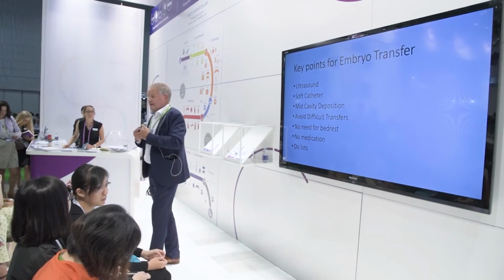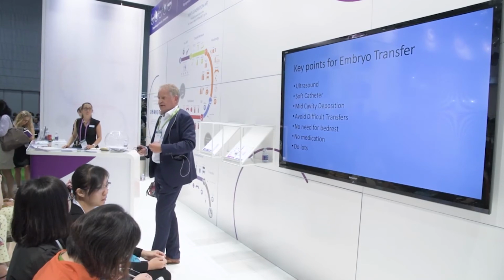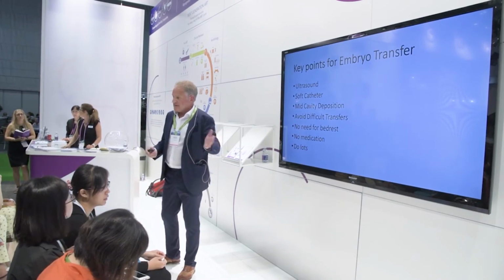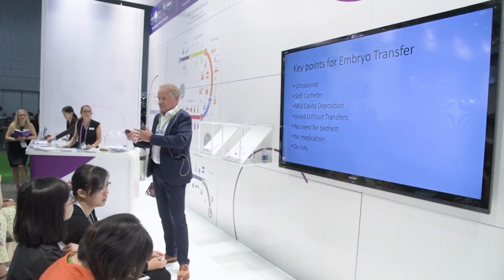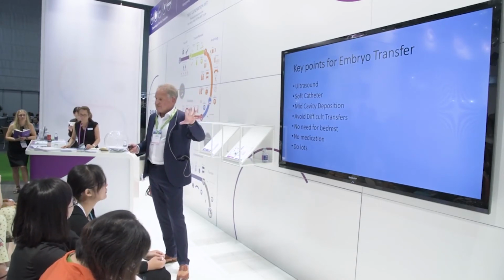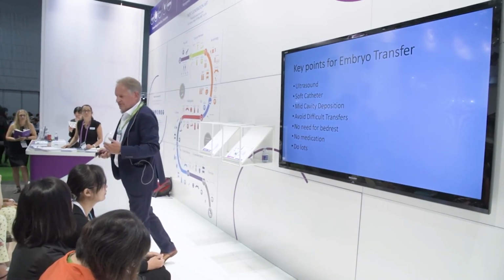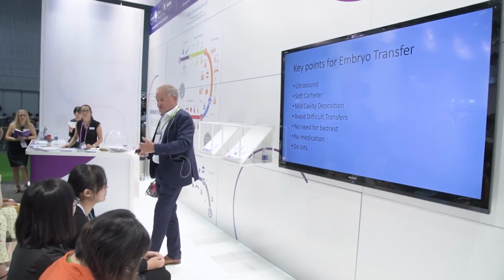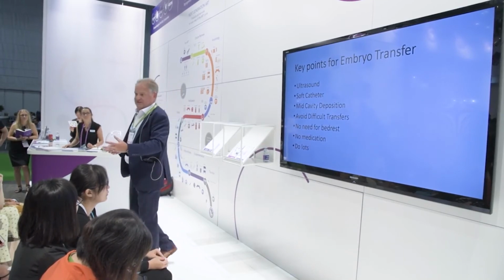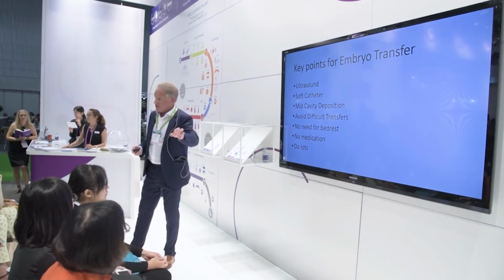Not only from your own clinical expertise or your clinical practice, but it's also far more reassuring for the patient to actually see where you put your embryos. And now it's a routine practice for us to demonstrate the embryo as it's inserted into the uterine cavity to the patient. And I'm not so sure that in the future we'll not have to have evidence that we have actually put that embryo that's been so carefully created by our embryologists. We will need to prove that we've actually put it where we said we'd put it.